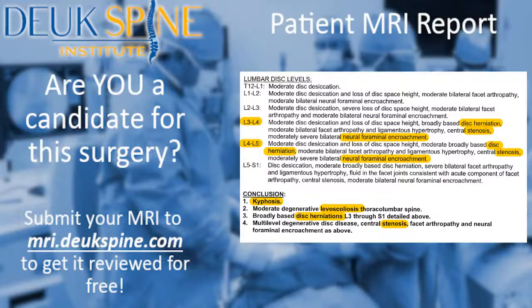2020, and we have reason to celebrate today. Anybody know why? Dr. Santiago is here. We're very pleased to have him with us. So we're going to be doing a Deuk Laser Disc Repair, lumbar, L34, L45, left side. Our patient has back pain and left leg pain, and they have a pinched nerve from stenosis. They have a herniated disc, L3-4, L4-5.